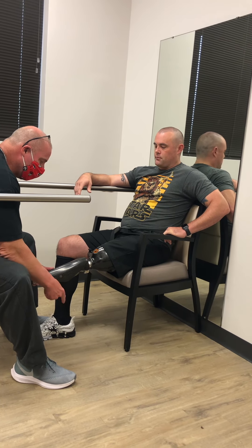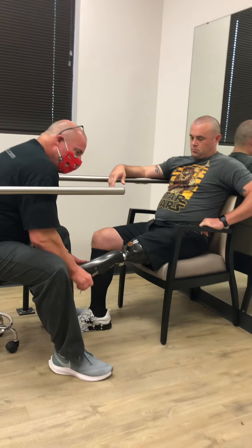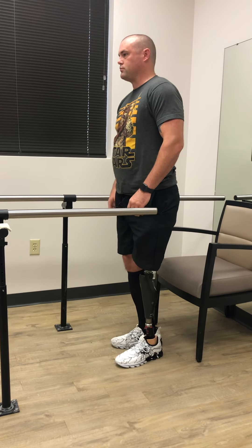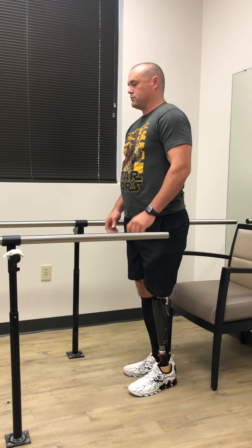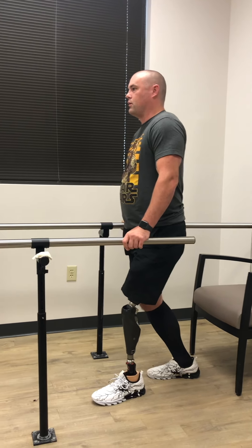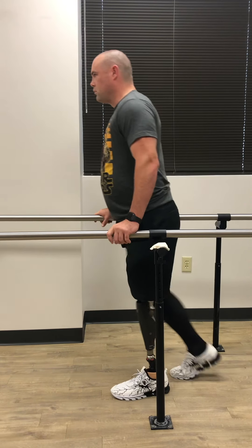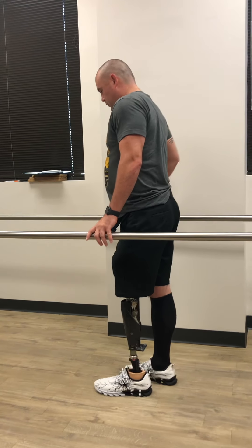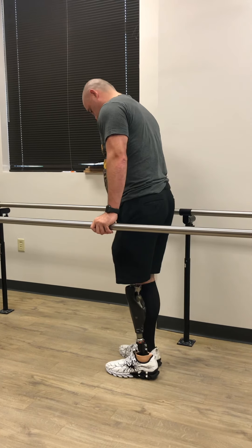So you can take some steps on it. You just don't know exactly — it will end up being a little short, not excessively short as it was. Even though nothing's set up yet, go ahead and grab the rails and take some steps. See how it floats? Try to keep it up under you. Collect your hamstrings and your glutes when you're taking a step. It's going high in some bad areas — we'll have to cut some of that frame down.